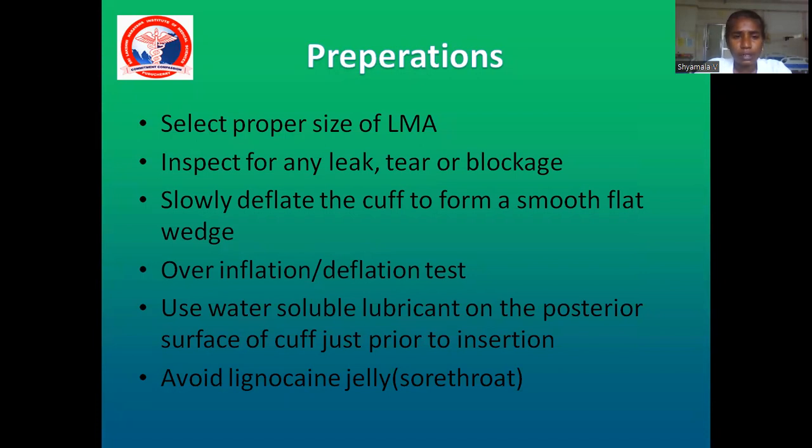Okay, then use water soluble lubricant on the posterior aspect of the cuff just prior to insertion. Avoid lignocaine jelly, because lignocaine jelly causes sore throat. Water soluble lubricant should be applied on the posterior surface of the cuff. You should not put it in the laryngeal aperture, only on the back side, because that is what you are going to place against the hard palate, and that way it will go in and lodge into the supraglottic space.